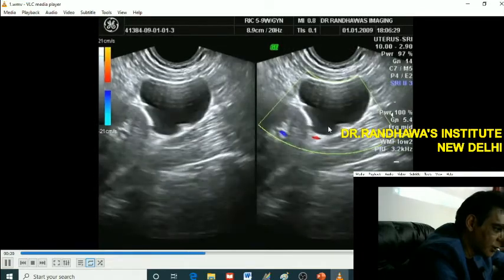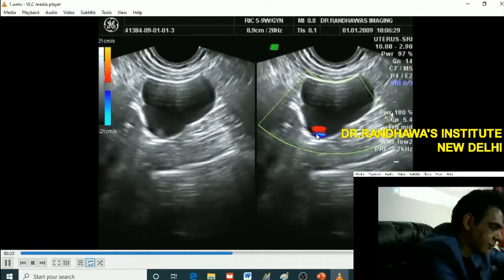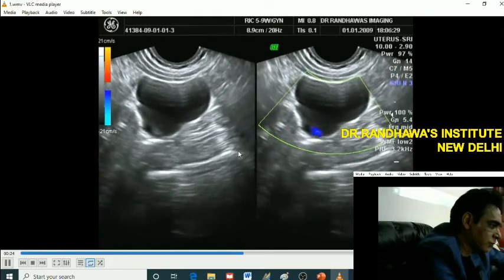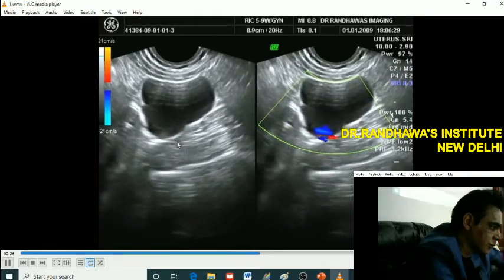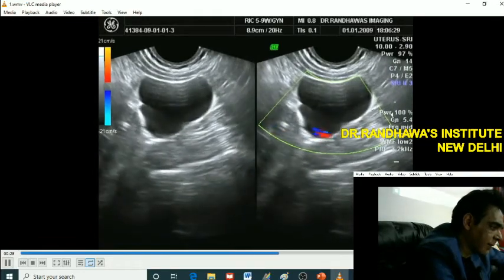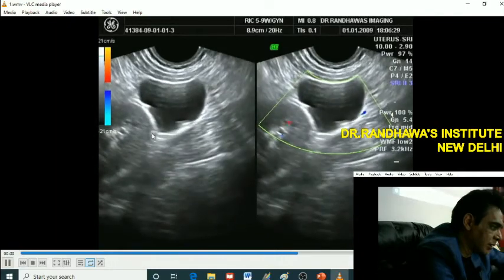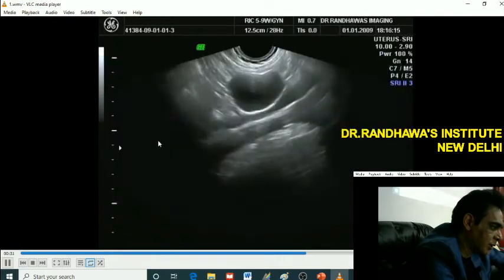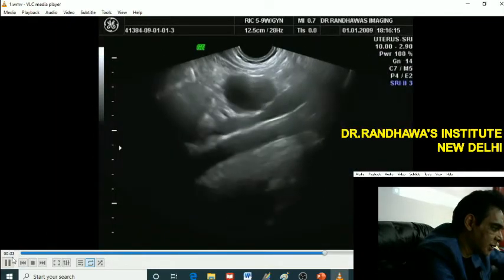We are putting color also and seeing these jets. As you can see, jet-like areas. You are getting the lower pole of the kidney and now you see these areas.